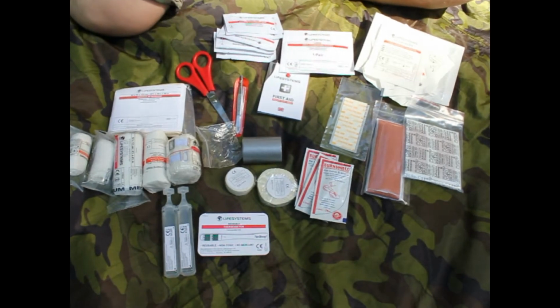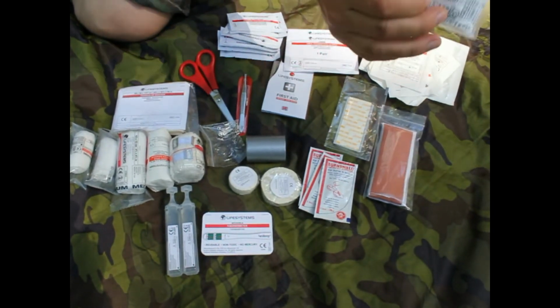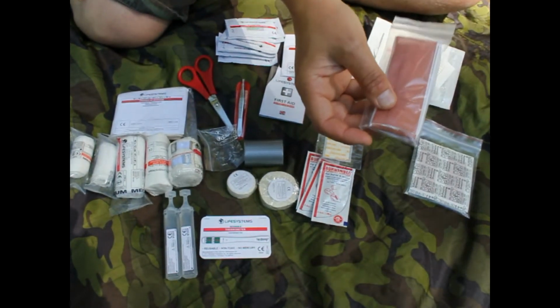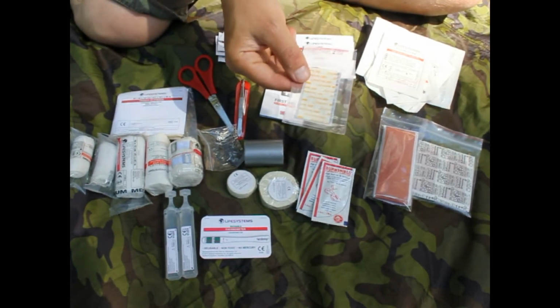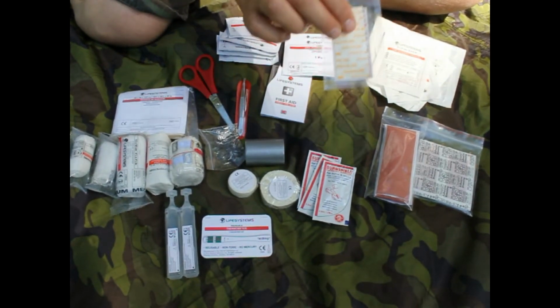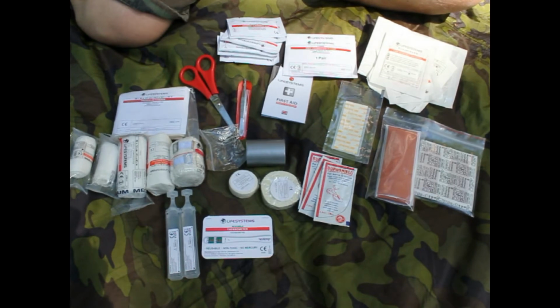So what do you use this for? Well, of course you have it for all the smaller wounds. You have regular tapes, like in the two other packages, different sizes. You also have cut-off tapes here. These are great for larger wounds also. And then you have these strips, excellent for large gaping wounds, where you can kind of put them together, and this will hold excellently well. These are sterile, and these are good if you get a large cut.